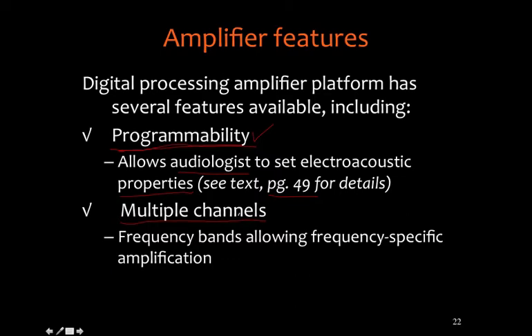Maybe at some point it will be, but at this point it does allow us to chop up the frequency spectrum of the input signal into multiple bands, and that allows us then to provide frequency-specific amplification, so that I can provide much more specific amplification for some frequencies as opposed to others. And that's an important feature. That really is a terrific advance provided by the digital processors.